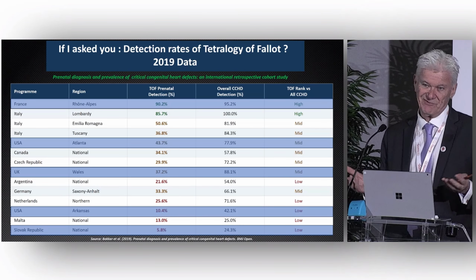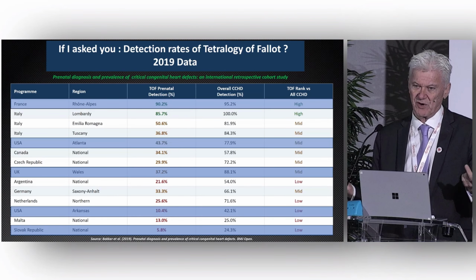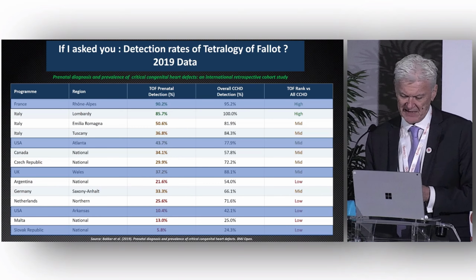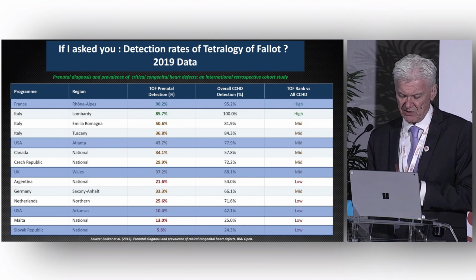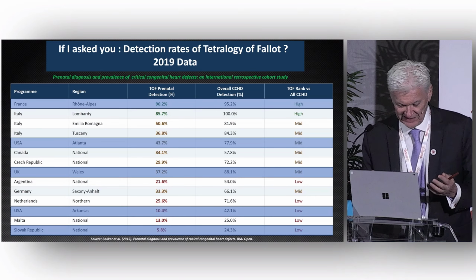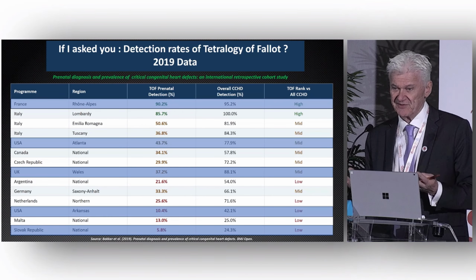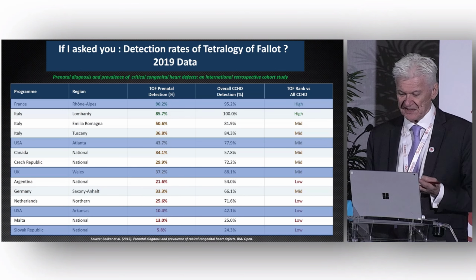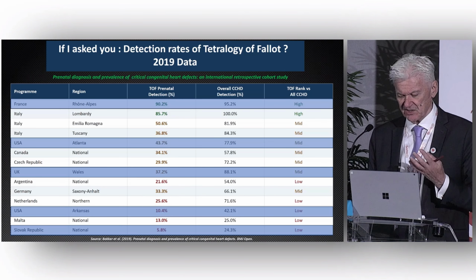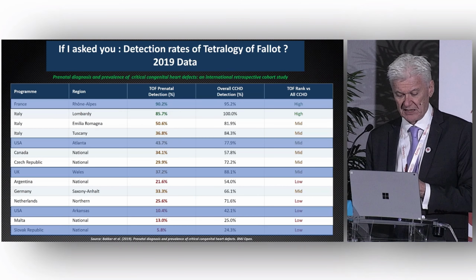And you say, Simon, why would it be different in one country when compared to the next, when many of us are working with similar healthcare systems and similar technologies, at least certainly in Europe? I think a lot of it boils down to actually having a protocol and making sure that you do a 5-section analysis. Because if you stick to a protocol, I think your detection rates will increase. And again, there's data to absolutely support that comment.